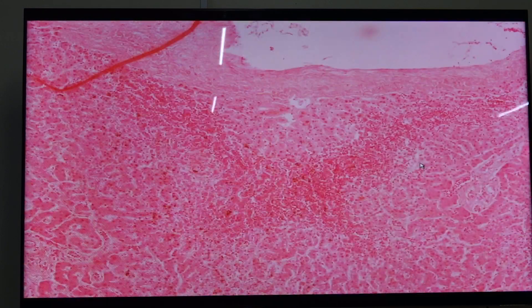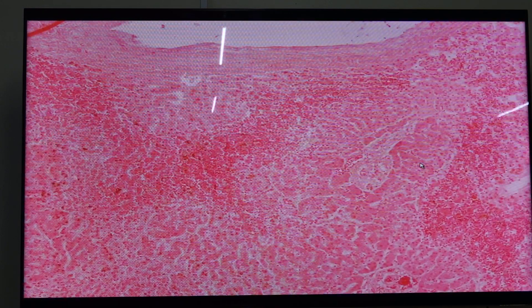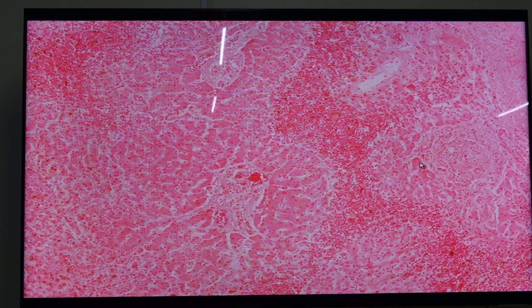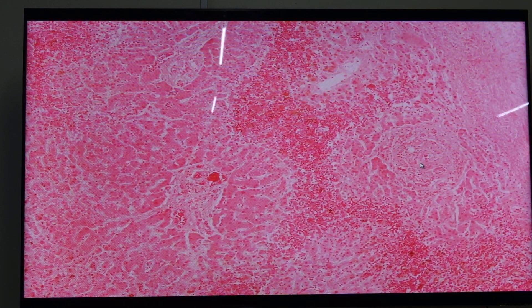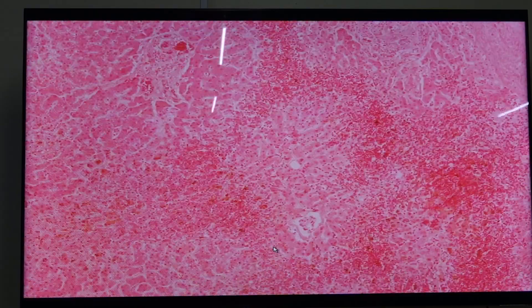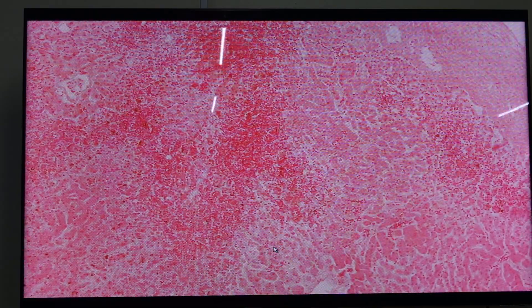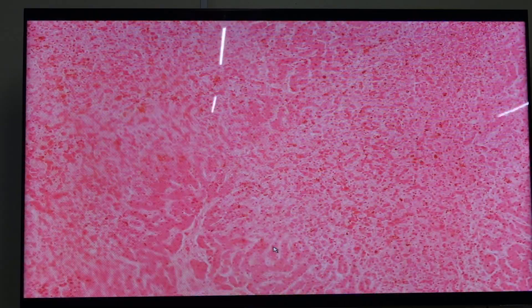Looking at the other portions, you can see the presence of necrosis and hemorrhage — that is the very important feature to look for. Our last slide for today is slide 183.